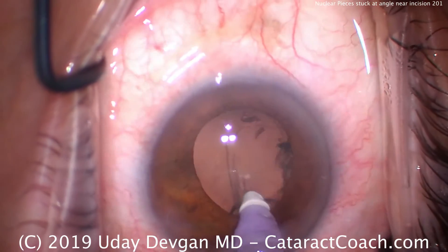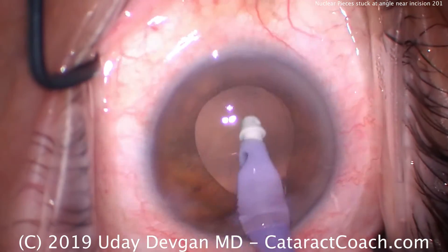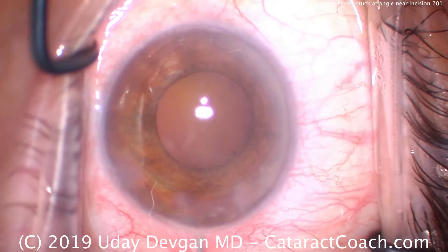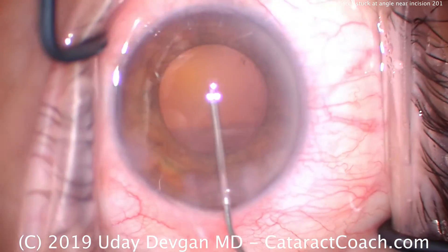We'll complete the cortex removal right about there. That looks great. Now there still may be another little piece of nucleus that's sub-incisional, just to the right of the main incision at the angle — but we'll find out.